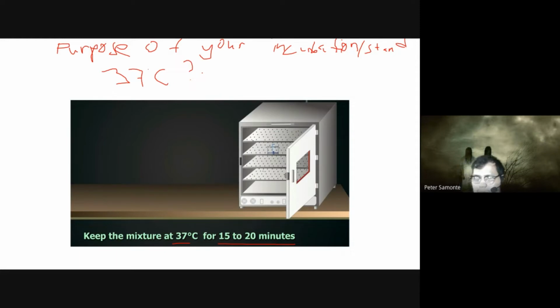Yung environment. Okay, better. Okay, here's a follow-up question. What temp would most cells survive? Anong temp? What temp would most cells survive? Anong temperature? Yan, tama yung sagot ni Miss Villarreal. To keep the cell viable. So, bakit kailangan viable siya? Ano ngayon kung patay o buhay? Bakit kailangan buhay yung cell?